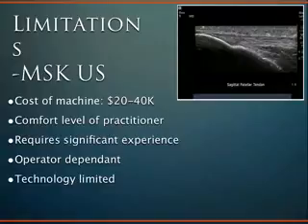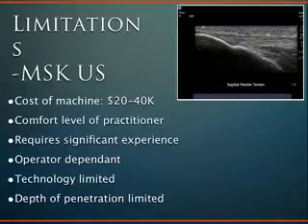And it's important with ultrasound, like any other imaging modality or diagnostic test in medicine in general, that you have to know the limitations of the machine. You have to know what it can see and what it can't see, because if you don't see it, it may not be because it's not there or the injury's not there. It might just be because you can't see it with ultrasound. So it's really important to know what you can and can't see, what you can trust with the ultrasound, what you can't trust. And there are limitations to the technology, and we'll touch a little bit on that as we go along. And again, that relates to the depth of penetrance, and you can't see through bones or deep into joints and things like that.